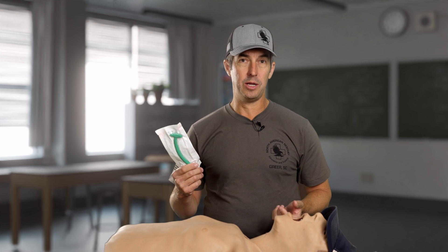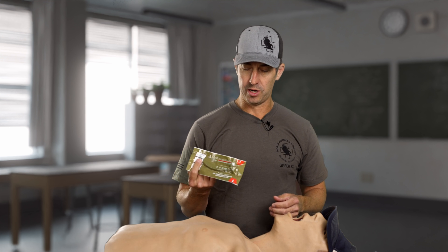In general, there are four different ways we can help get air moving in and out to help a patient's airway, really from least invasive to most invasive. Number one, we can put an NPA in — a nasopharyngeal airway. This is the one from North American Rescue; it comes in a pre-lube pack. We put that in either nostril, and it goes down and keeps that soft palate up so the patient can keep breathing on their own.